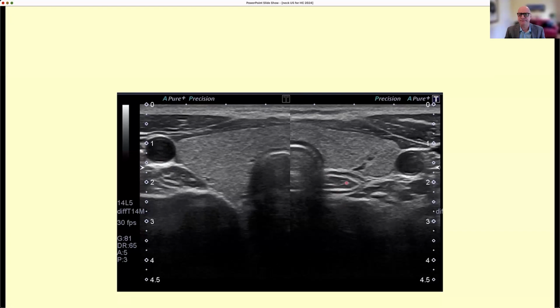What about this? Esophagus. Exactly, that's the esophagus, and you can distinguish it by this triple layer, typical structure, very clear. Never mistake this for a nodule. It is the esophagus. If you are in doubt, ask the person to swallow, and you'll see bubbles of air in the saliva that appear as they cross the esophagus.